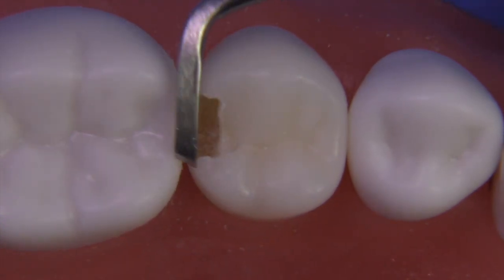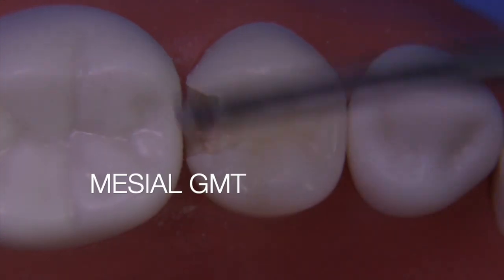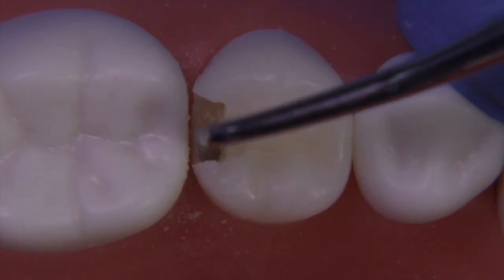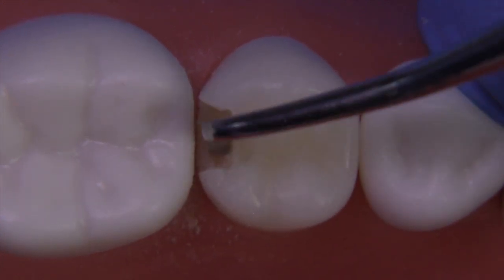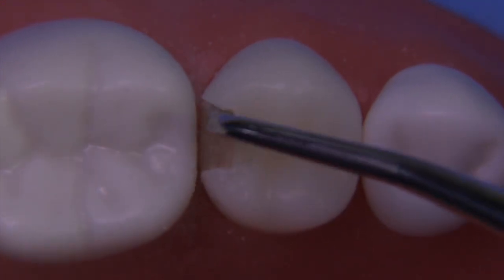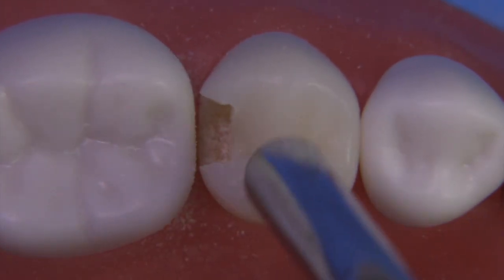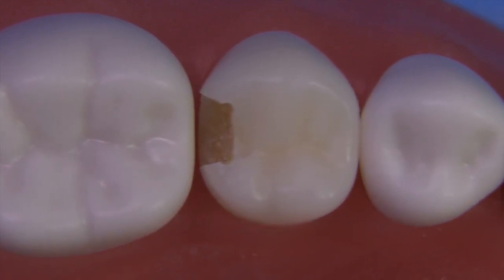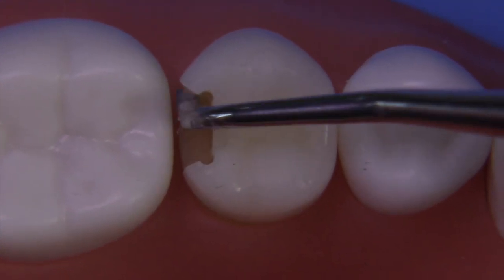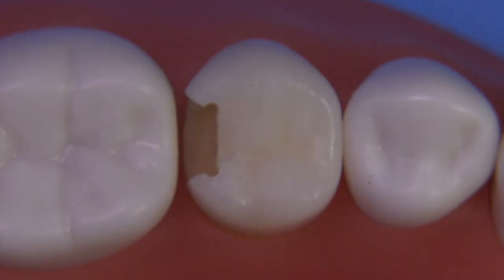This is an interesting switch — I'm using a mesial marginal trimmer, not the distal, to enhance the line angle between the axial and the gingival. We're scraping this way, almost creating an inward retentive groove, a ditch if you will. There would be nothing wrong with running a little retention groove across the gingival, much the same way we do on a Class V preparation — a gingival retention groove for an amalgam prep, and sometimes with a composite. Now we're also going to use the distal gingival marginal trimmer to apply a slight bevel to the gingival wall and run up the facial and lingual walls as well, much in the same way we use the hatchet.